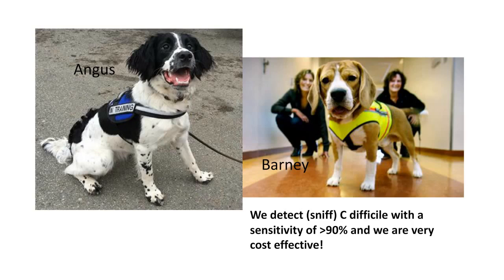Thank you, Dr. Morgan. Last question, how do you report lab ID events in NHSN for CMS? If the molecular test is positive, but the toxin test is negative, does it still get reported as a lab ID C. diff, or only if both tests are positive? Yes, we consider the PCR test as our screening test, and our test reportable for reportable infection and treatment is the toxin A and B. So that is what we are reporting. We do not want physicians to necessarily take action on the PCR positive, toxin negative patients. We are doing this to assist our infection control practitioners.